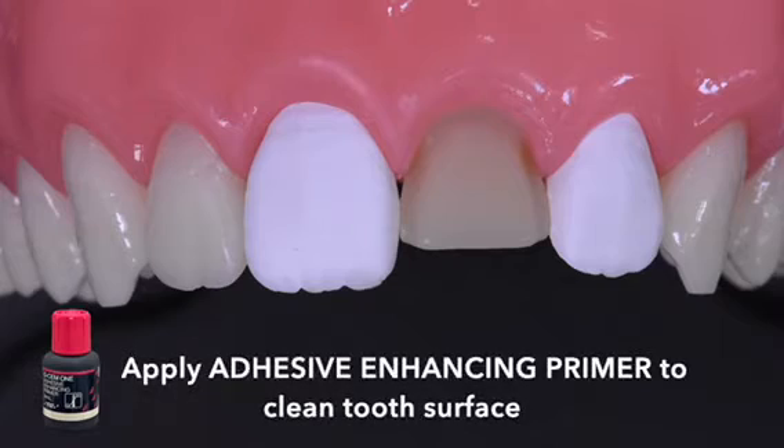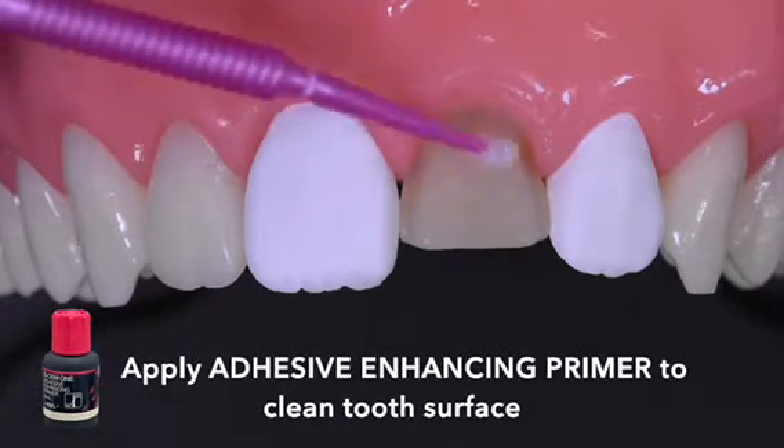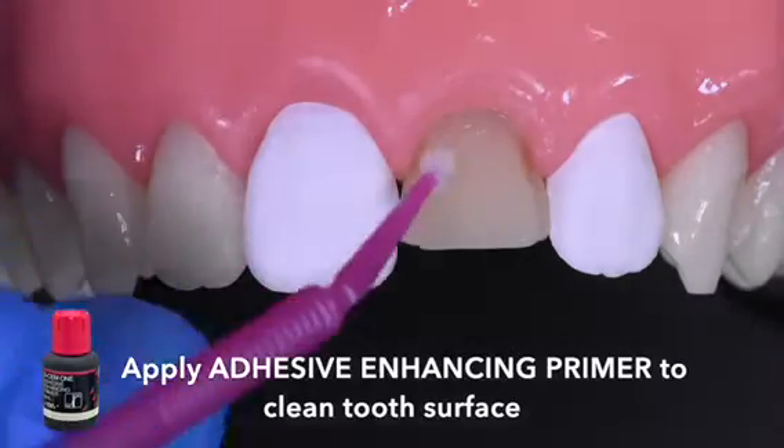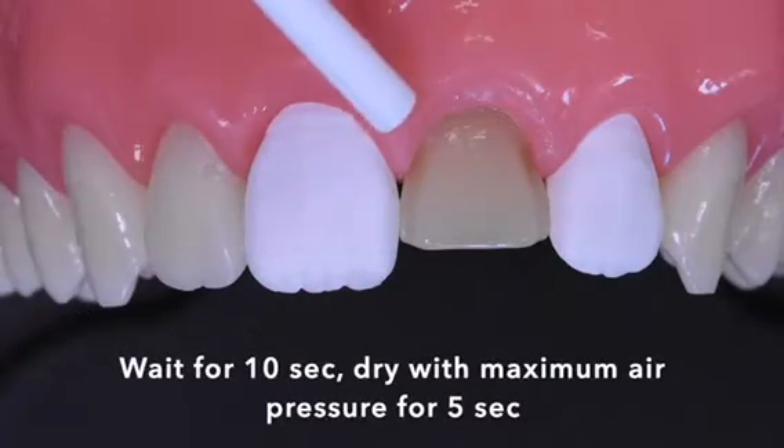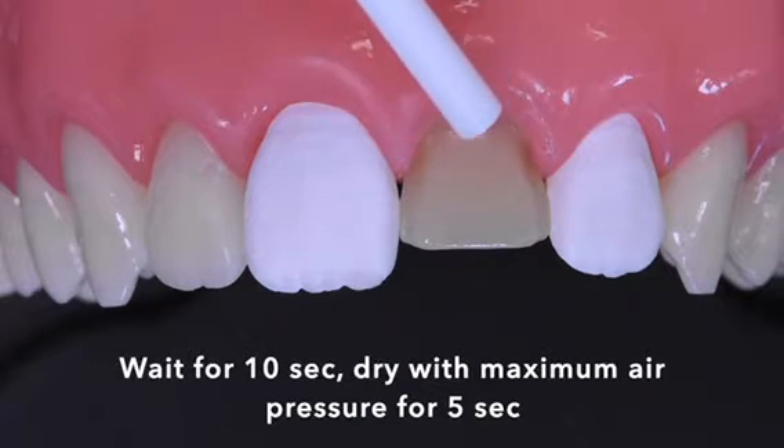First, apply the adhesive enhancing primer on the clean tooth surface. Wait for 10 seconds and dry with maximum air pressure for 5 seconds.